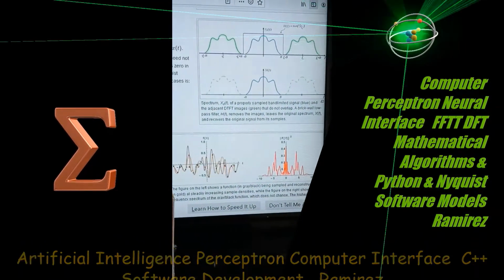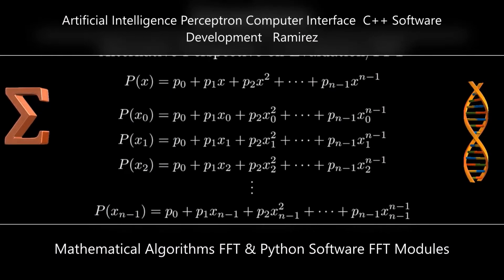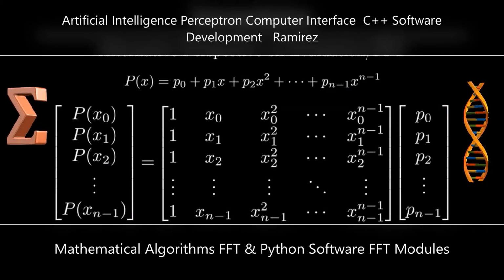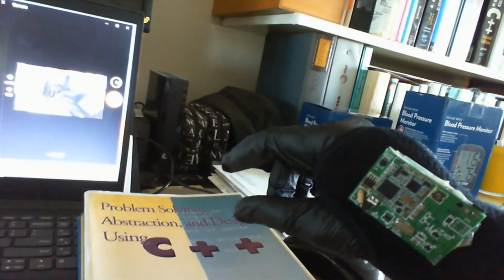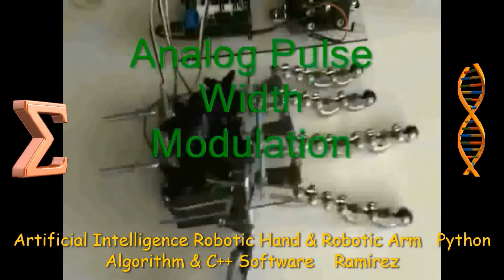As a result, the length of the FFT transformed signal was n_fc equals 110. The resultant feature vectors computed along each channel were stacked together to form a matrix with several dimensions.